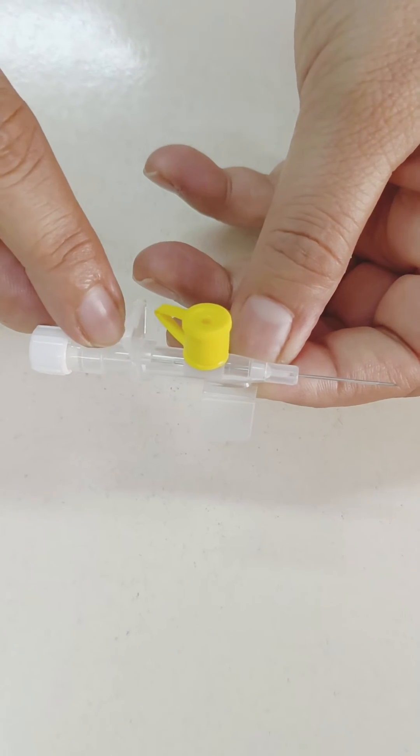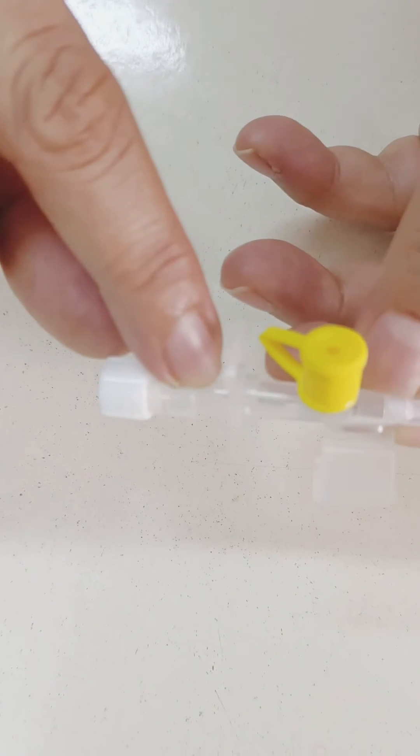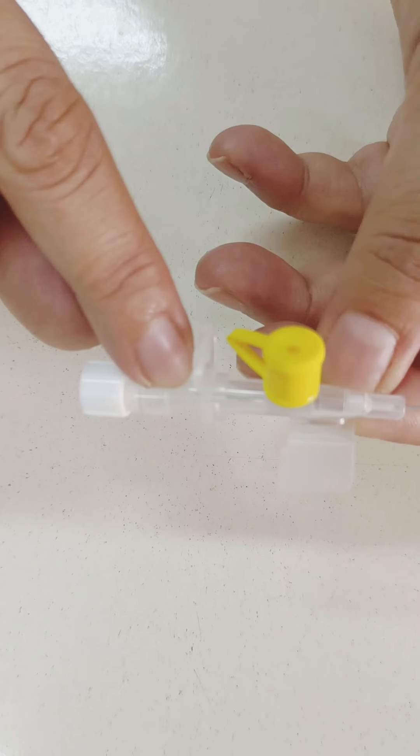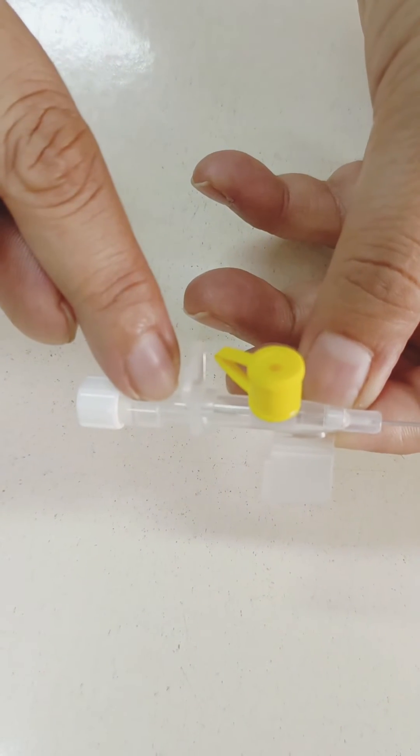This is flashback chamber. When intracath is inserted inside the vein, blood comes in this chamber.